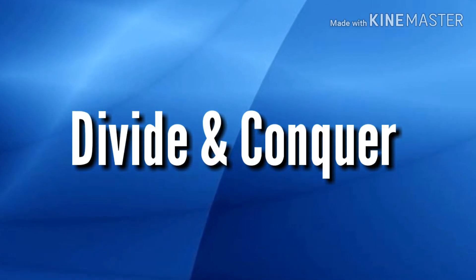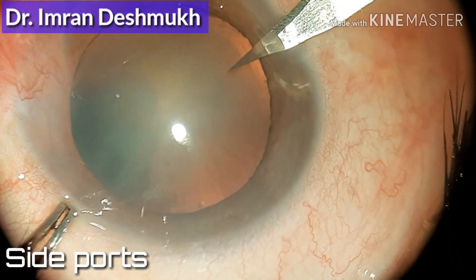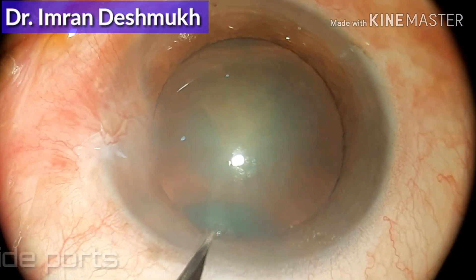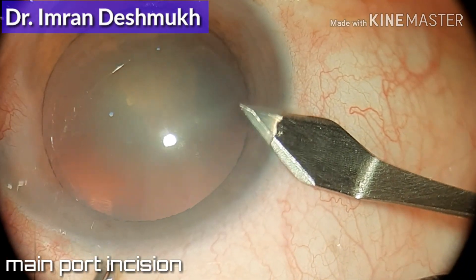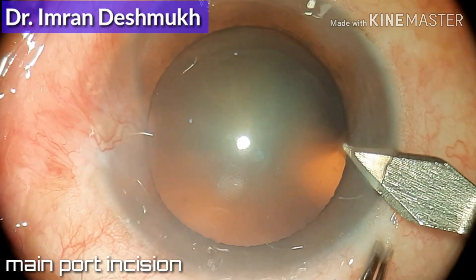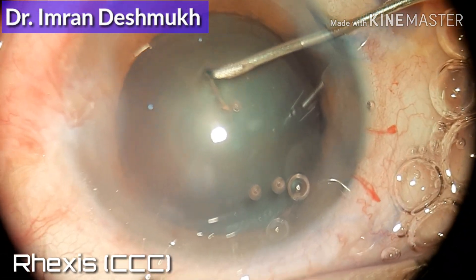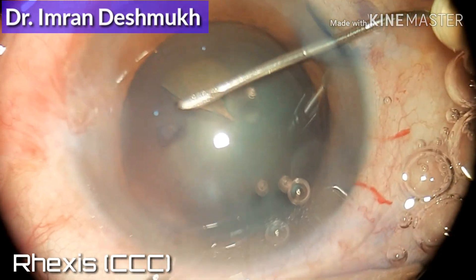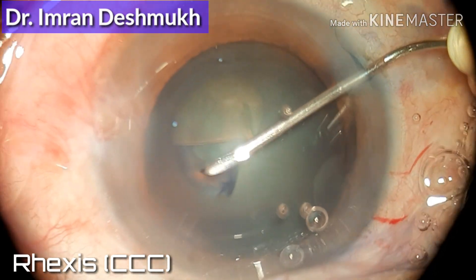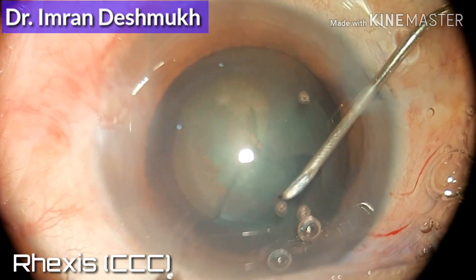Hello everyone, today we'll be discussing how to divide and conquer the nucleus in the case of phacoemulsification cataract surgery. Last time we discussed how to stop and chop the nucleus; today we'll be discussing divide and conquer, after going through all the basic steps of phacoemulsification cataract surgery.